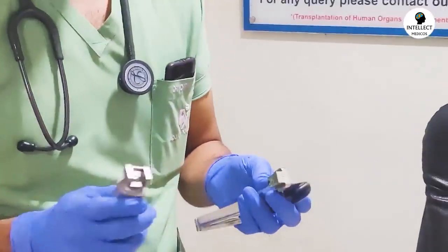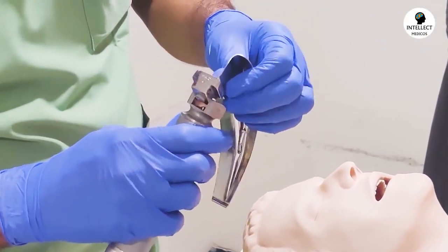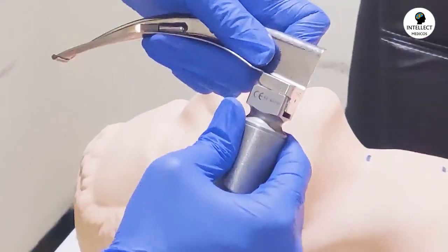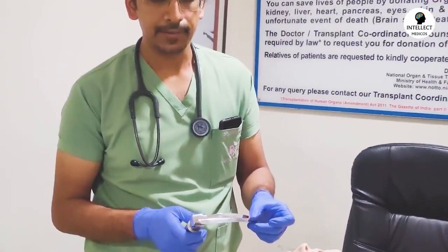This is a very important step. There is a groove over here in the handle, and you just have to insert this blade like this, and then you just have to straighten it like this, and there will be a light. Now you need to see whether this light is adequate or not. How to check it?